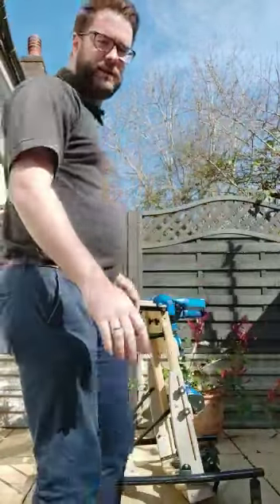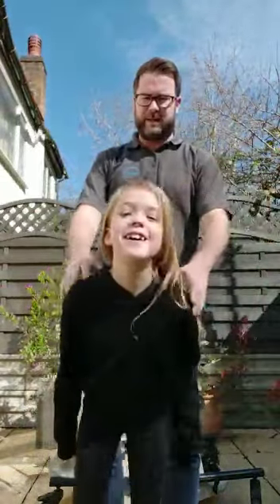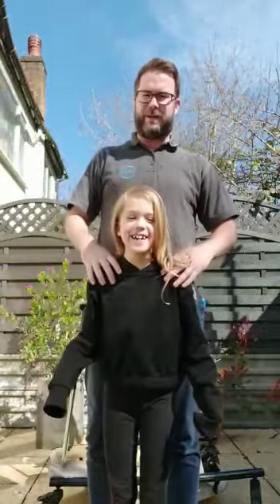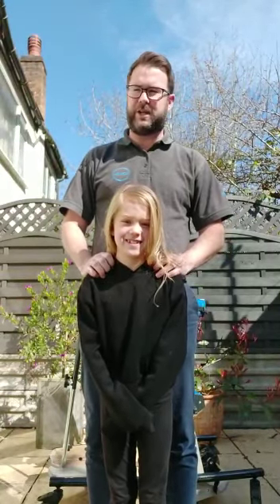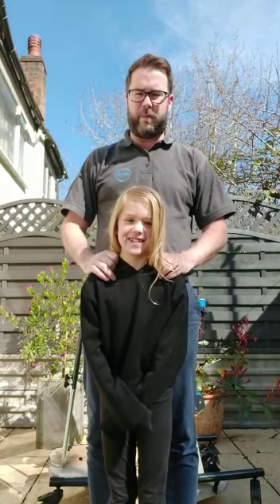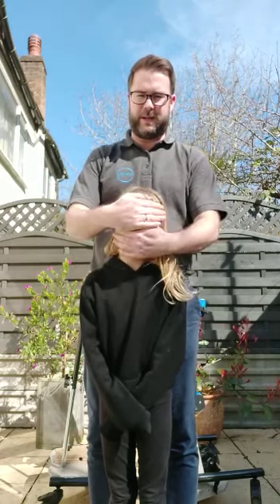Hi everyone, I'm Bella, I'm Laurence's daughter and I'm helping my dad with this video — the only reason I've agreed is because I get out of schoolwork. Right, so everybody, we've had a few requests of how to do standing transfers and transfers from a chair into one of our prone standing frames. So I do apologize about the quality of this video as my daughter's in it.